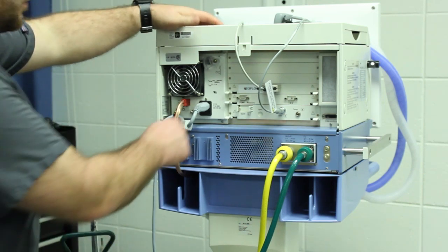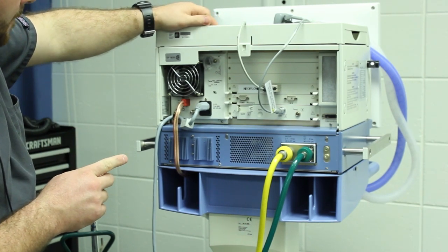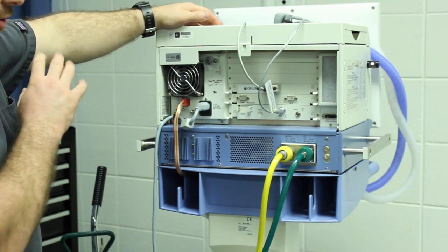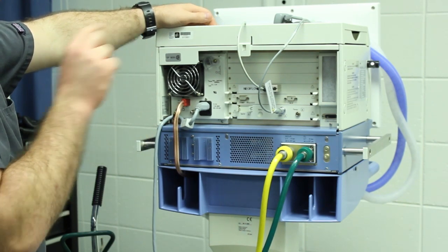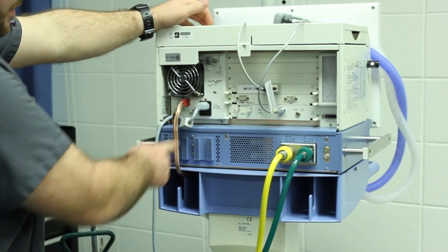It does have an internal battery — I think it lasts two to three hours — but I'm not sure how charged yours will be. It may initially run without being plugged in, but it will alarm and say something about the battery at the top, which means you probably just need to plug it in.